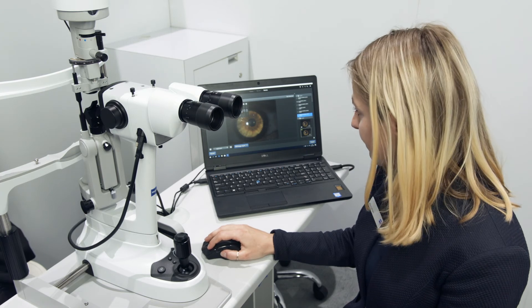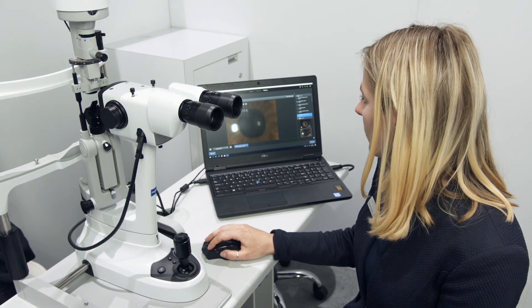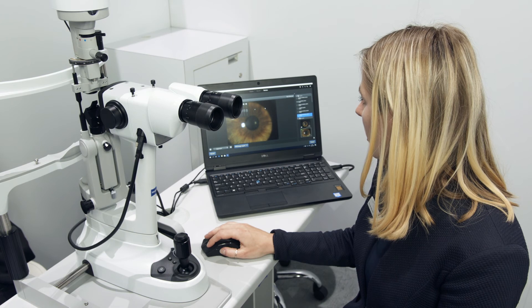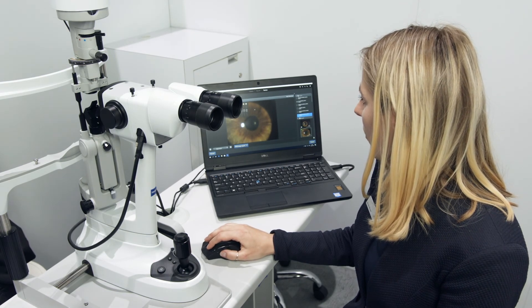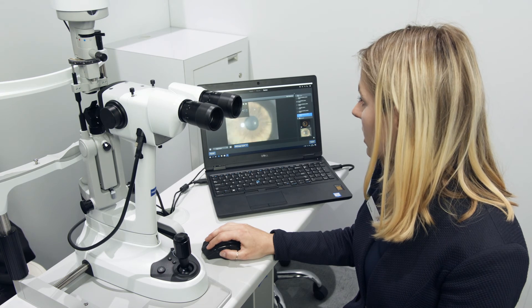It's also possible to edit images — you can zoom, rotate, or even adjust the brightness. A lot of things can be done with the imaging software.